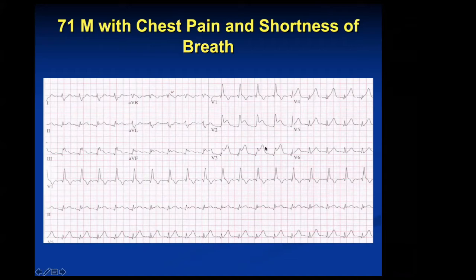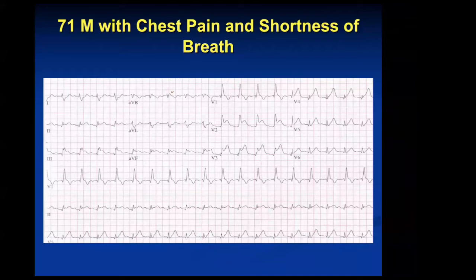So what territory would this be encompassing? Someone in the chat says LAD — that's right. That is LAD. Now what area would be represented by leads 2, 3, and AVF? There are ST elevations there as well. After establishing your isoelectric baseline, you can see those clear ST elevations in these three leads. Someone says inferior RCA — good job. That's exactly right.